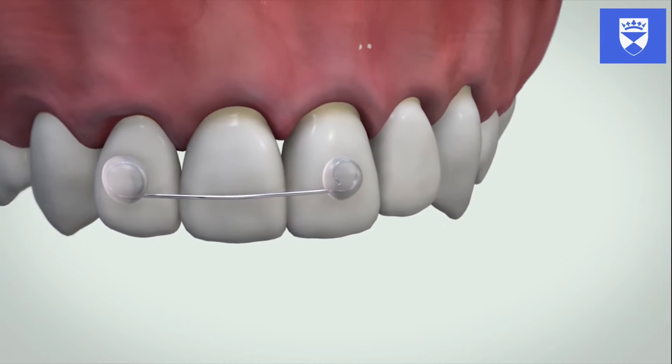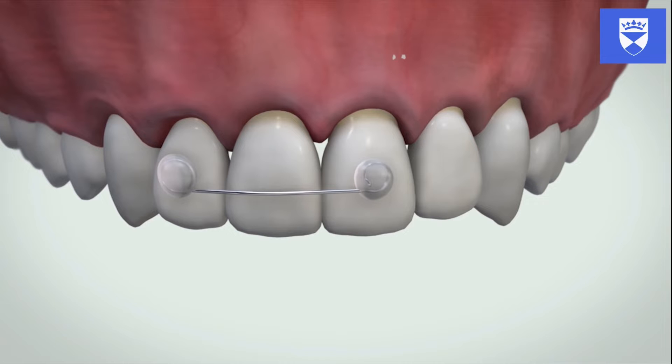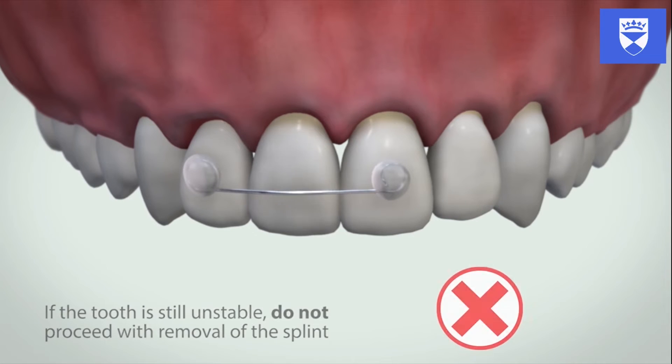It is now time to assess the mobility of the previously traumatized tooth. With only the traumatized tooth separated from the splint, assess its degree of mobility. If the tooth has excessive mobility, composite can easily be reattached to rebond the splint and the splint can be left in situ for a little longer. The decision on whether to keep the splint on for longer must not be taken lightly and will also depend on the nature of the injury. If it is still mobile, further investigation and onward referral is usually required.